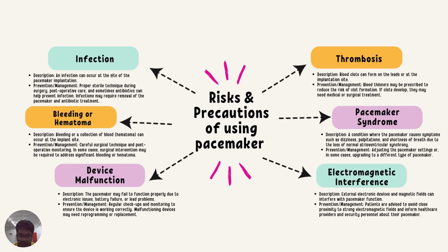External electronic devices and magnetic fields can interfere with pacemaker function. So, how to prevent that, or the precaution to handle that, is that patients are advised to avoid close proximity to strong electromagnetic fields and inform healthcare providers and security personnel about their pacemaker.